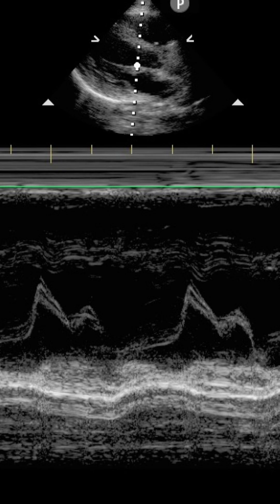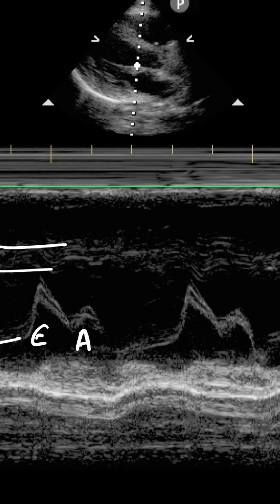For context, we're looking at the intraventricular septum right here. We're looking at the mitral valve leaflet movement in this waveform here, with our E wave representing the passive filling during early diastole, and the A wave representing active filling during atrial contraction.